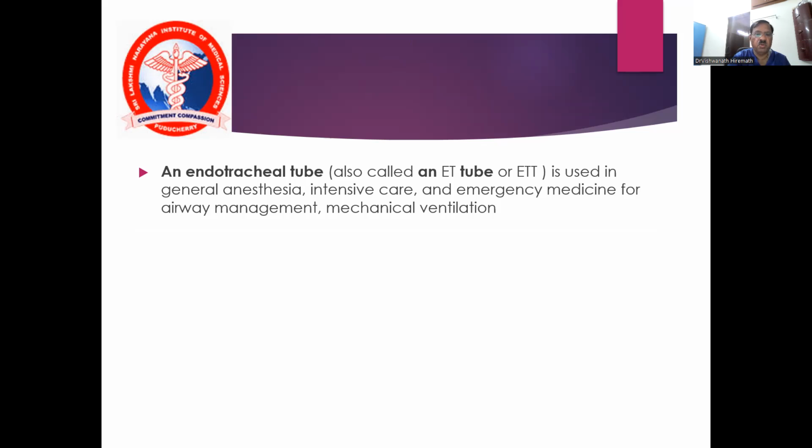This you have to practice on mannequins under the guidance of anesthesiologists or emergency care physicians, and gain additional knowledge when you are posted in the anesthesia department during your internship.